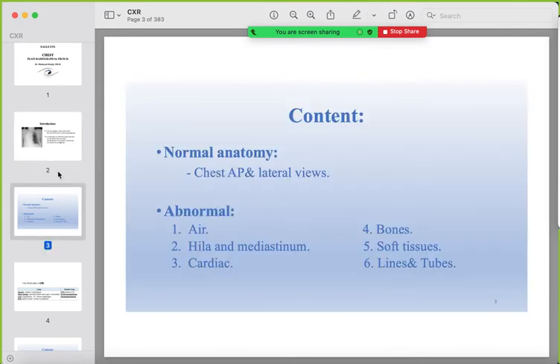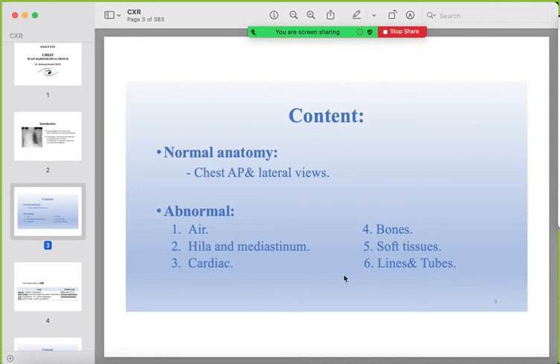Our content today: we will talk about the normal anatomy of the chest radiograph in the AP and lateral (frontal and lateral) views, and the abnormalities that could happen. These are organized into six points: air in the lung or outside the lung, the hilum and mediastinum, the cardiac part, bones, soft tissues, and lastly lines and tubes.